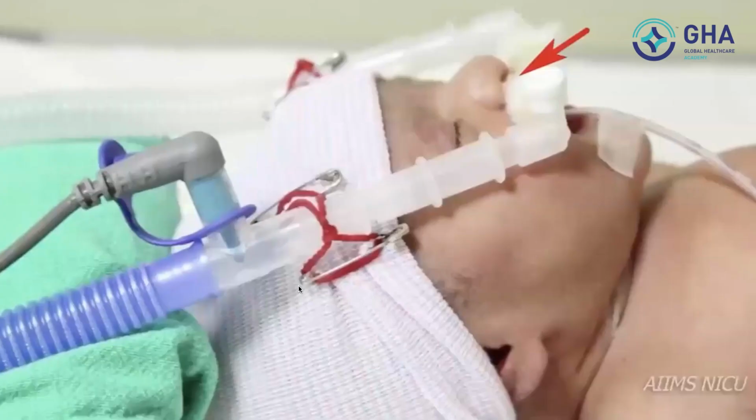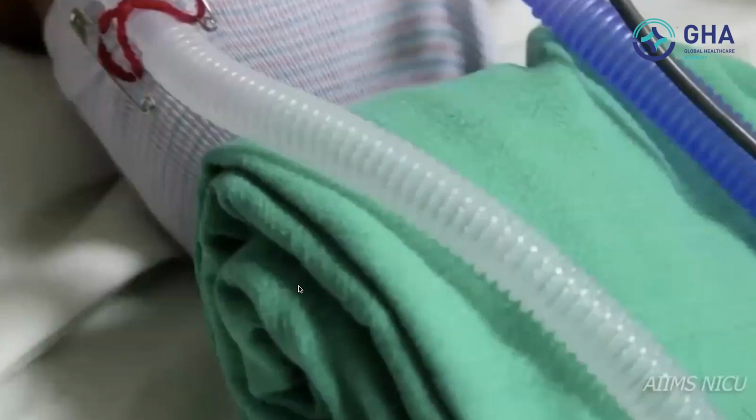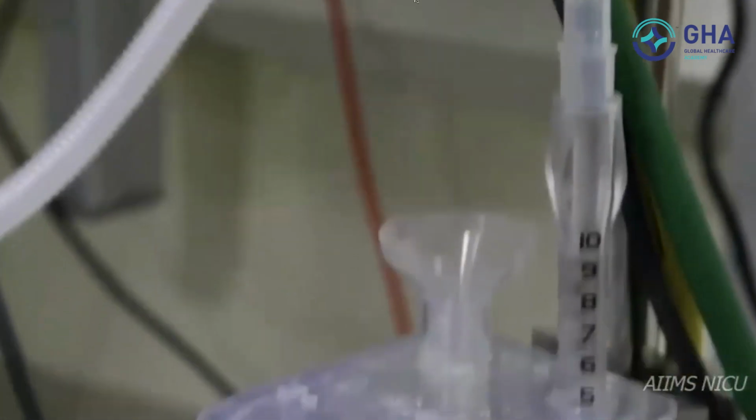Ensure that there is some distance between the prong and columella. The expiratory limb is inserted into the bubble chamber. Watch for the bubbling and water level, and also check for the set pressure in the bubble chamber.